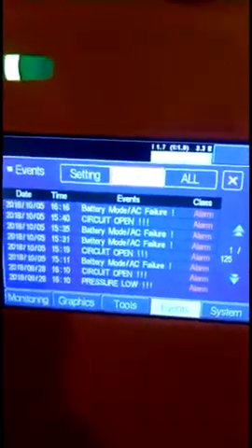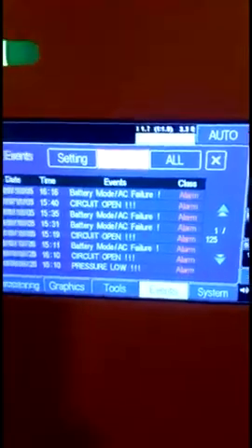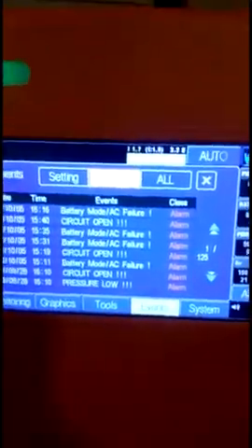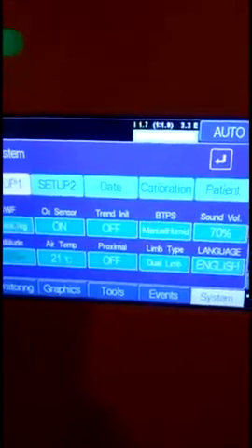You can check the log to confirm what settings have been made and verify the ventilator is operating according to those settings. You can also view all alarms from the past 24 to 48 hours, and the history stores up to 1000 events, so you can review all the logs.